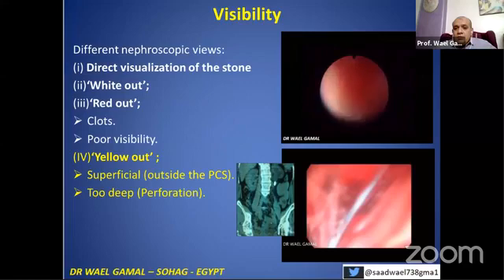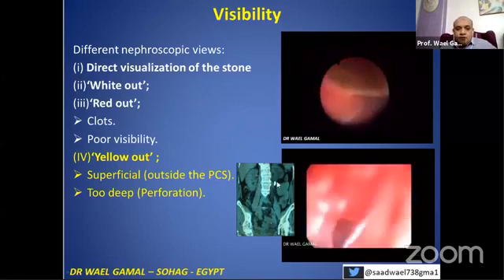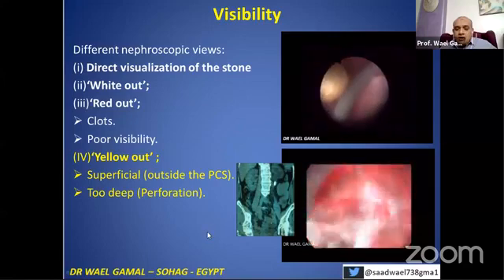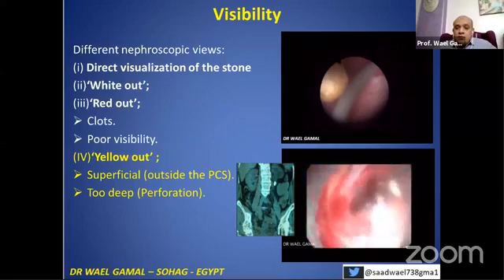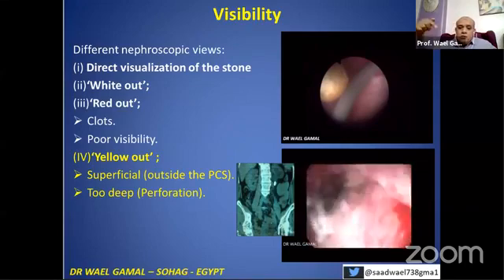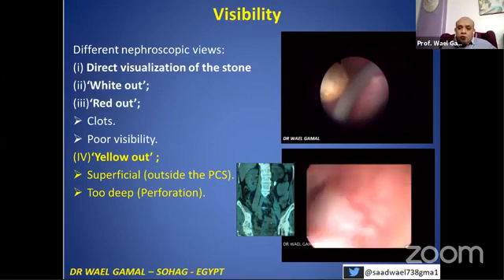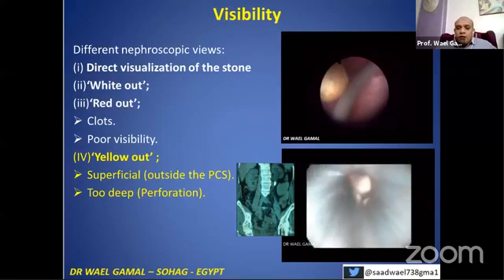If the dilator was in and you were sure you were inside, you can manipulate the tip of the nephroscope to enter the pelvicalyceal system. In another case — stone, PUJ, and you see the yellow sign — the sheath is too far inside, so you have perforated the pelvicalyceal system. Go backward, looking for the mucosa. Go backward and look upward; you will find the pelvicalyceal system and the stone.